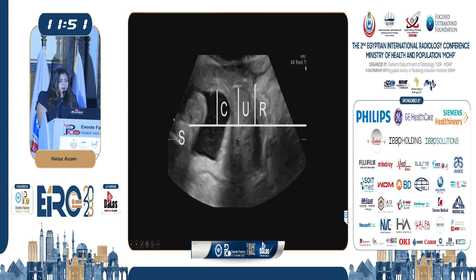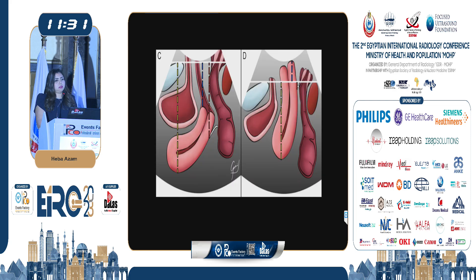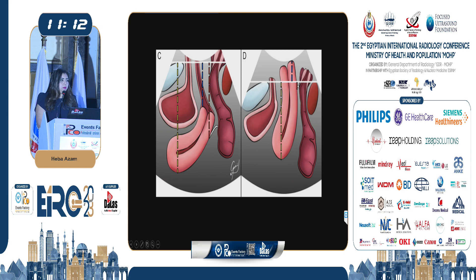We can assess pelvic organ prolapse by drawing this reference line and measuring the distance from it to the organs — the bladder base, the uterus, and the rectal ampulla. For the uterus, we must differentiate between uterine prolapse and cervical elongation. Garcia suggested measuring a line from the inferior border of the symphysis pubis to the uterine fundus during resting and straining. If the difference between resting and straining is more than 15 millimeters, this indicates uterine prolapse; if it is less than 15 millimeters, it indicates cervical elongation.